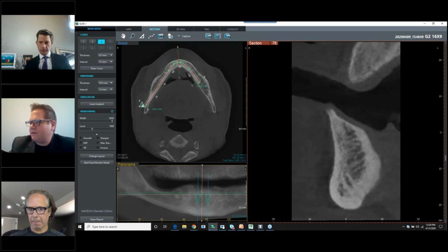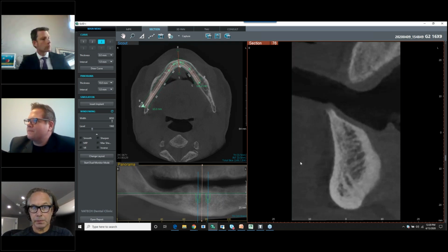Let's see. Can you talk a little bit? A couple of people were asking about sending guides to labs. So can you just talk about that while you're looking? I just had one. What's that? You cut out there for a second. You broke up on me a little bit. Can you repeat the question, please? Somebody's asking about sending the scans out to labs for guides, what our options are.